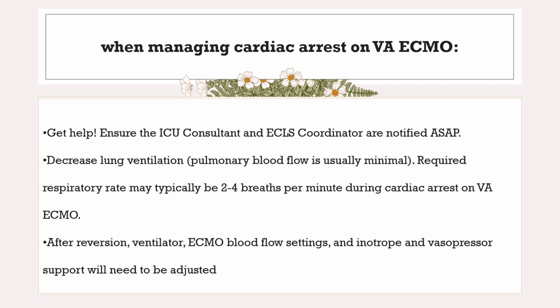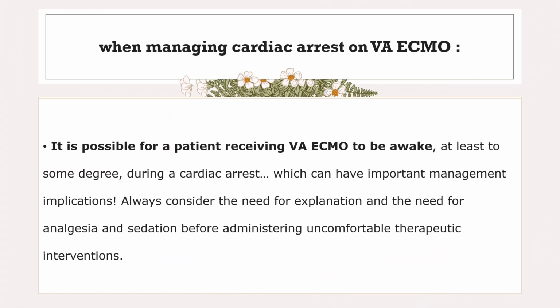After reverting the patient or restoring ROSC, we should adjust the ventilator. ECMO blood flow settings should be adjusted. Inotropes and vasopressors also need to be adjusted and revised. It's very important to note that patients who are receiving ECMO are sometimes awake. So at least during cardiac arrest, we should consider the need for explanation and their need for analgesia and sedation before giving uncomfortable interventions such as a DC shock.